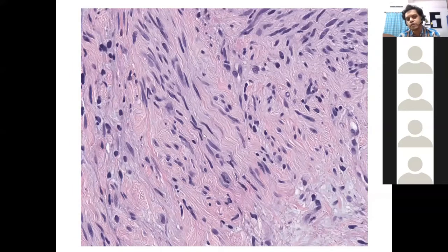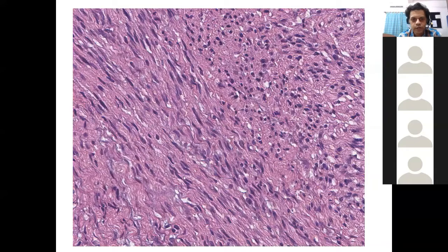So this is the thing for the juniors. This is the kind of cell that you often look out for if you are trying to pin this particular feature onto a Schwannian tumor. See this zigzag nature, slightly serpentine appearance of the nucleus. So this waviness of the nucleus is one important clue towards it being a Schwannian cell. If you are seeing that, well and good, but sometimes you will not get to appreciate this waviness, zigzag nature of the nucleus. Okay, so again here you are seeing the zigzagginess of the nucleus.